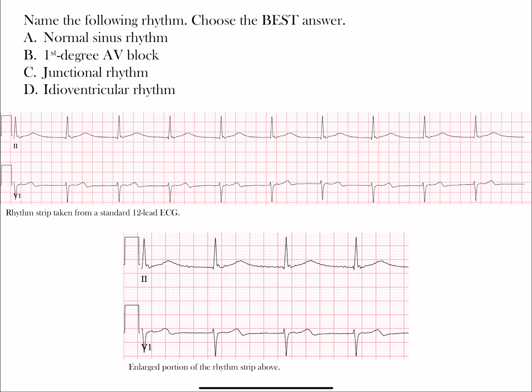Here's our next rhythm challenge. Name the following rhythm and choose the best answer: A) normal sinus rhythm, B) first degree AV block, C) junctional rhythm, or D) idioventricular rhythm. Take a moment, pause the video, go through it, try to choose the best answer, and then we'll walk through this together. Let's look at each of these answer choices and see why the correct answer is correct.